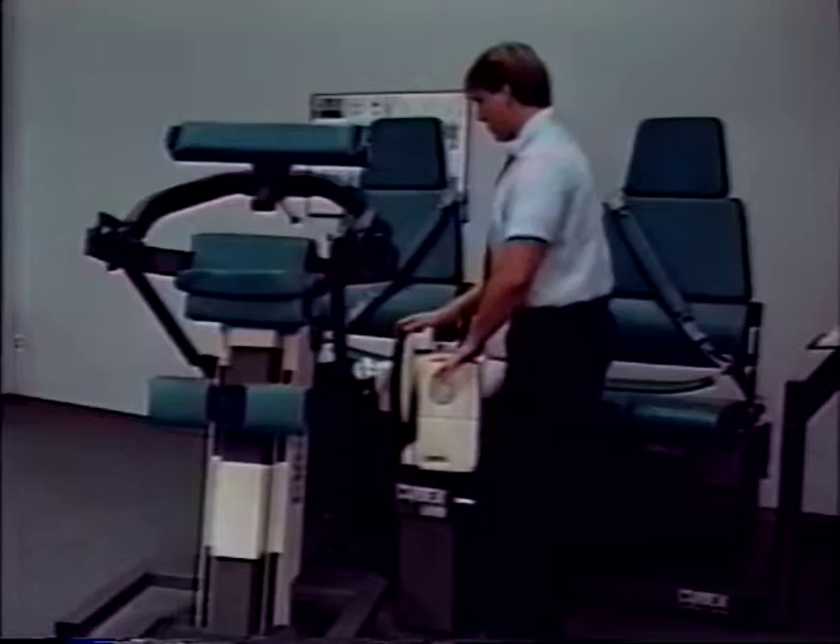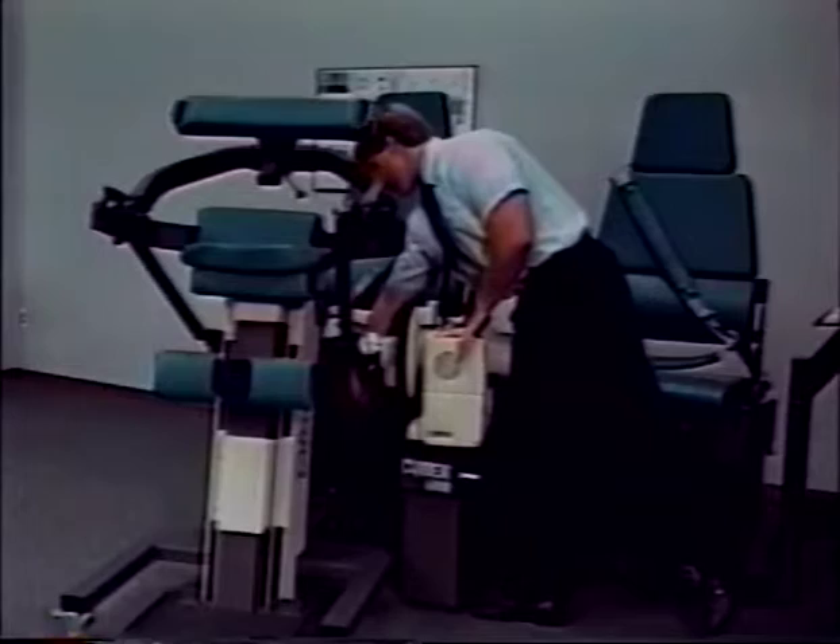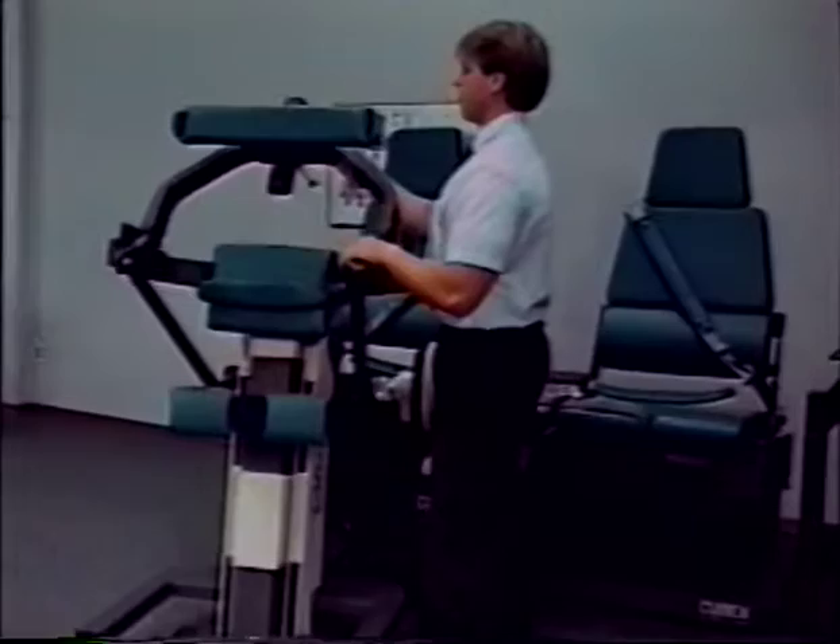With the 9/16-inch wrench, tighten the four hex head screws along the sides of the rear of the TEF modular component. Move the TEF modular component input arm assembly through the range of motion several times — it should be free of any binding.